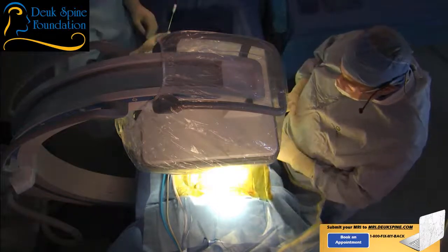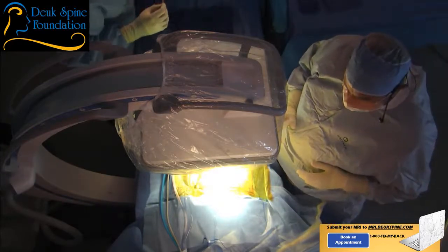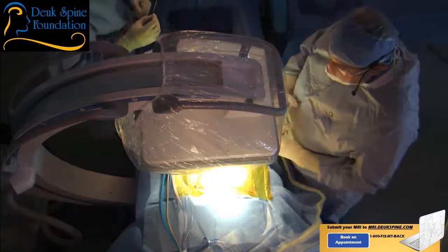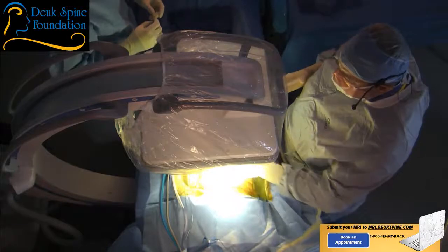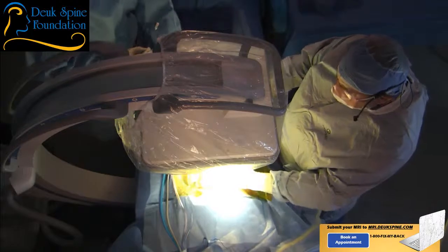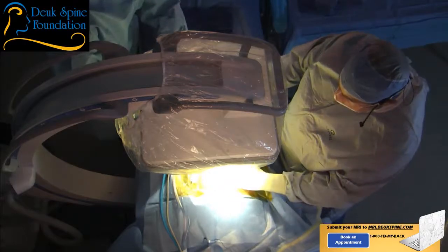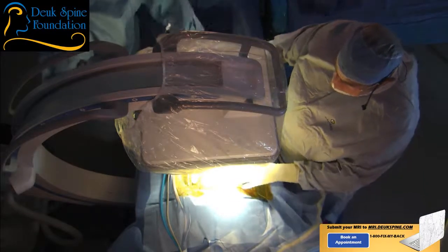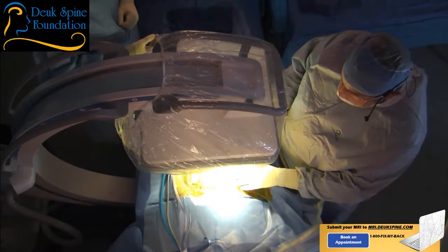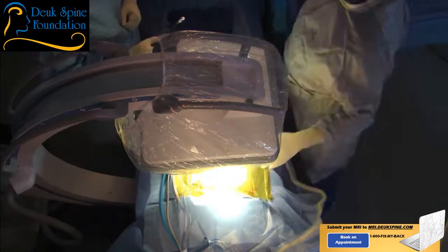Don't try to move. Just say 'ouch' and let me give you more numbing medicine. We'll mostly use a little more propofol. Are you comfortable? We're going to put you to sleep in about 10 minutes from now. When you wake up, we'll be done. Little stick and burn — that's just the numbing medicine going in. It's totally normal.